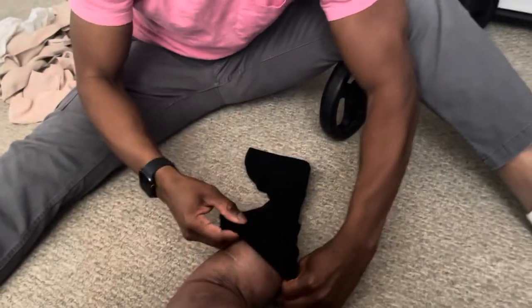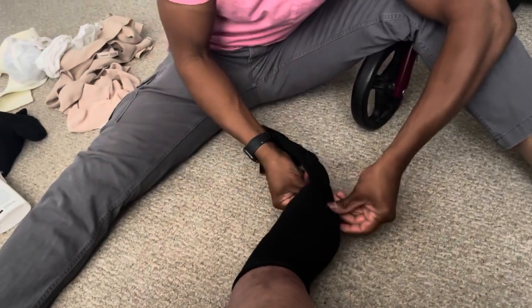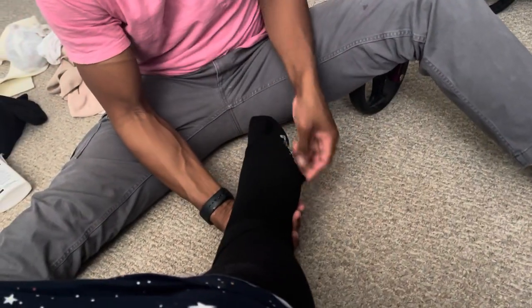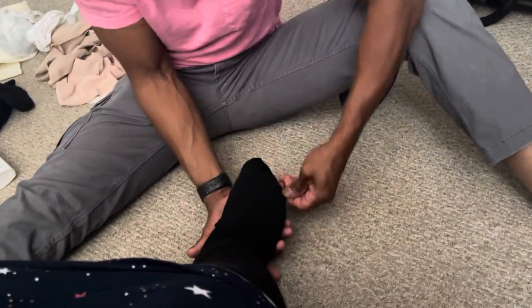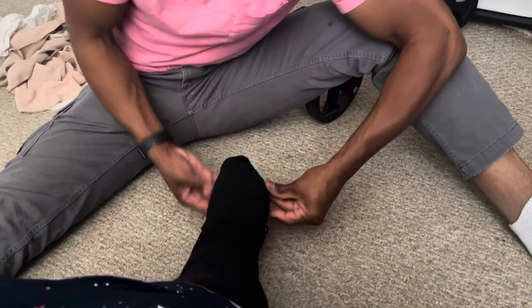Now, the underlying sock here gives compression from the ankle to the toes only. The ankle to the calf is not compression given by the underlying sock — compression from the calf portion is actually given by the garment. With the sock, you want to make sure that you pull it all the way up the leg, that the heel portion is right in place, and that the toes end at the end of the sock. Make sure there are no wrinkles to ensure that the fluid flows correctly.